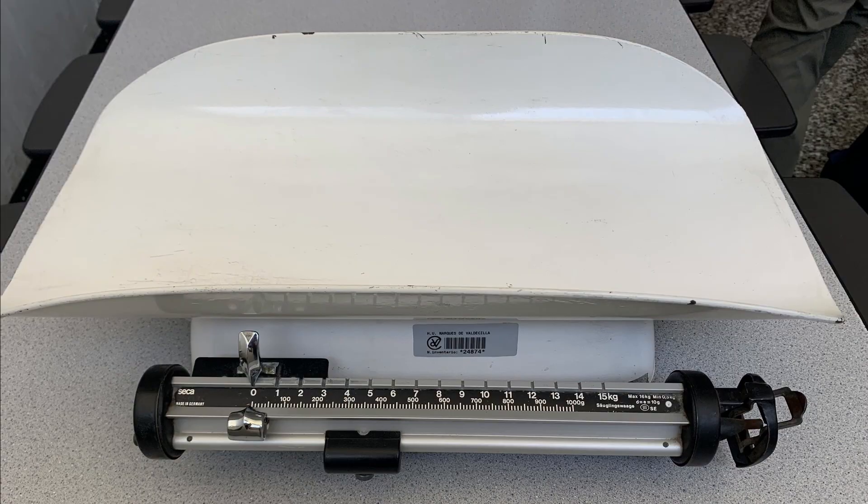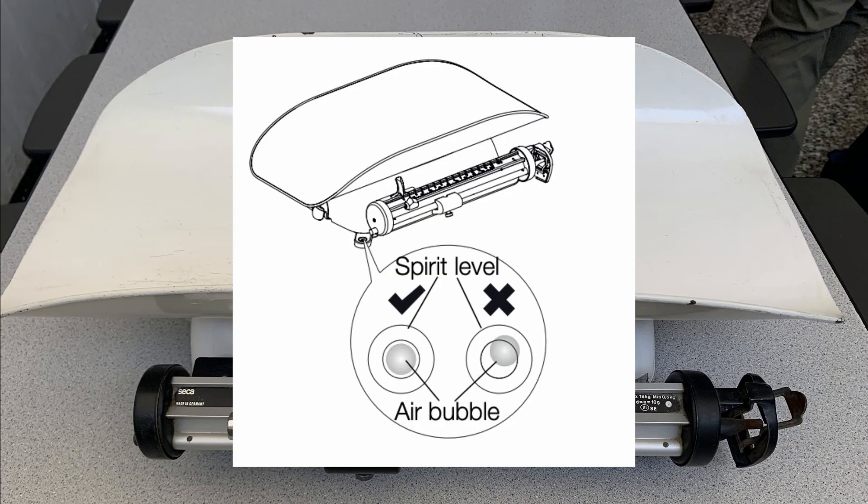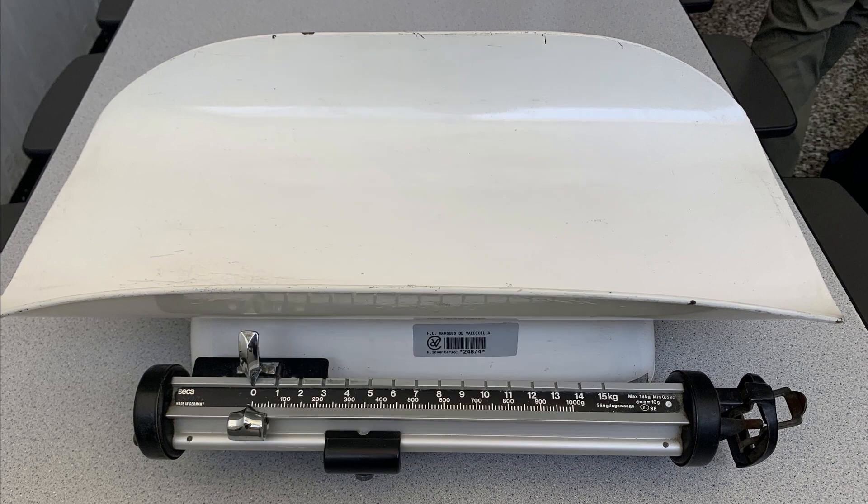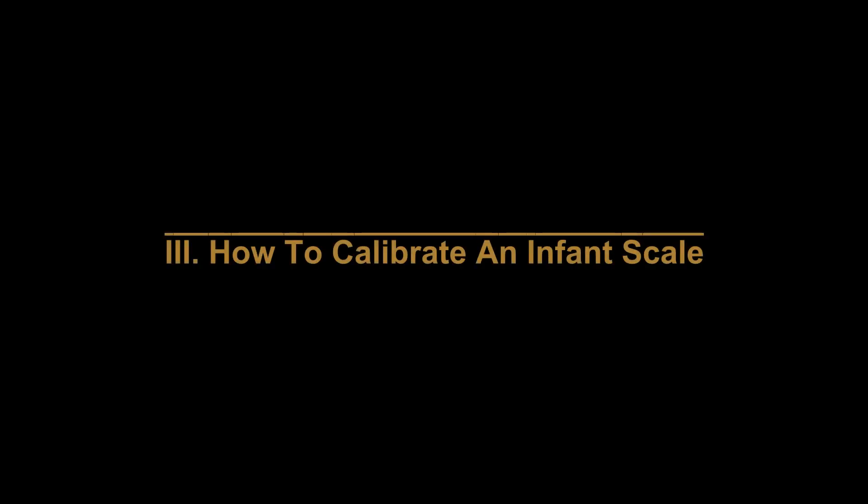The entire infant scale must be level in order to accurately weigh the infant. The level of the infant scale can be determined by a level indicator if present. The scale is level when the air bubble lies entirely within the circle or lines. If your scale does not have a level built in, an external level can be placed inside the weighing basket to ensure the scale is leveled.